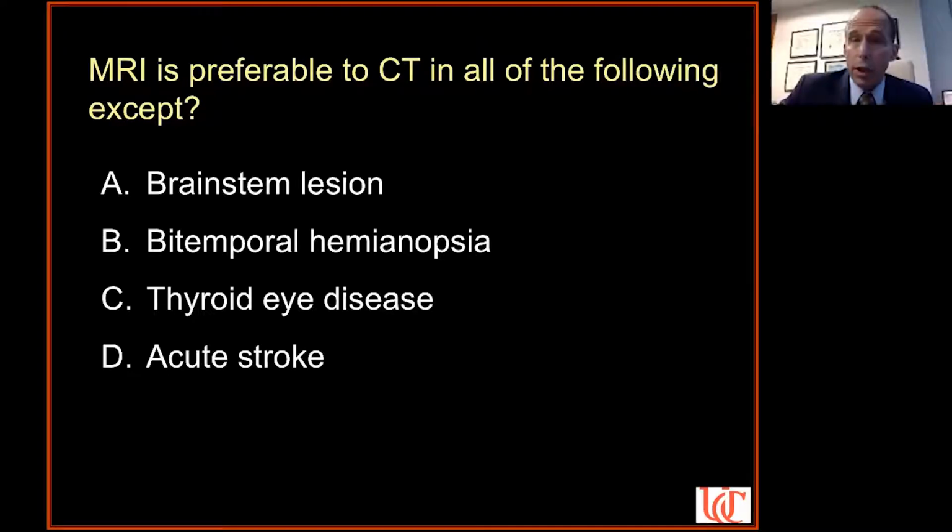Now, if there's a hemorrhage in the brain, that's another story, and either an MRI or a CT would show that. That's why, at least in the United States, if you go in and they think you've had a stroke, they want to rule out bleeding in the brain because that can kill you quickly, whereas an ischemic stroke probably won't. So they often will do a quick CAT scan to rule out blood. CAT scans are good for blood, but if it's ischemic and there's no blood, then the CAT scan can look totally normal, and we'll get to that in a moment.